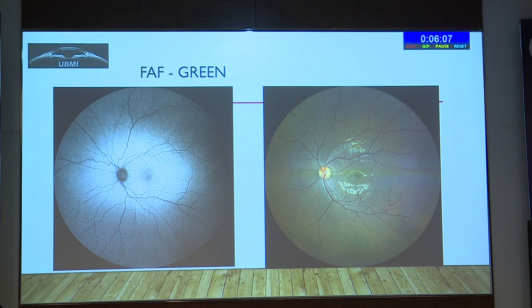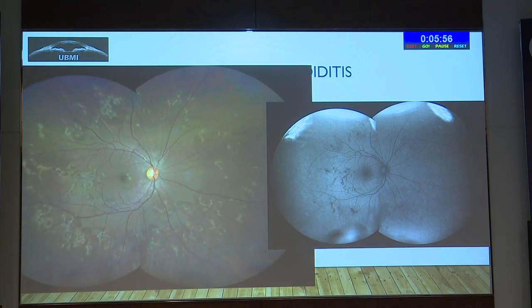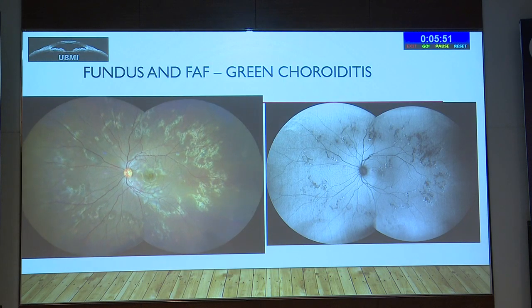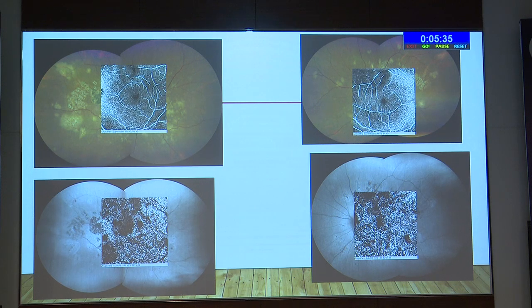The FAF is also very good on this, and it has both blue and green, so you can go to any extent and see that. We had a fundus with healed subretinal... You can see the two resolutions on blue as well as on green in the other eye. This is a healed case, and the single area can be seen very well. Another case where you can see the entire extent. This acquires in probably 3 to 4 seconds. It's just 2 images, and they montage automatically.